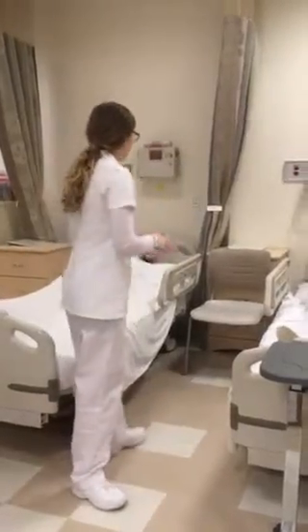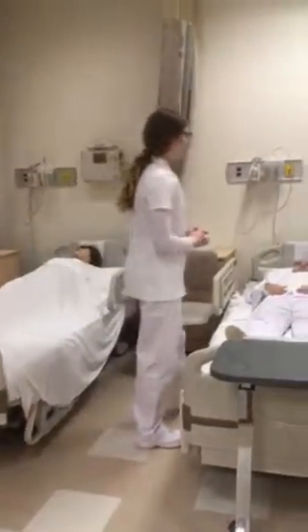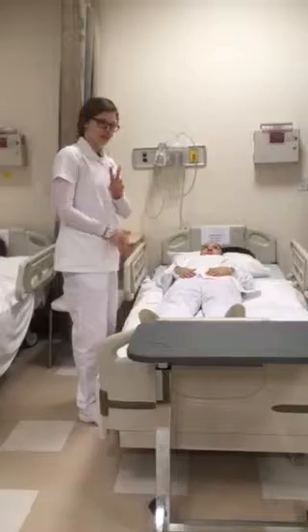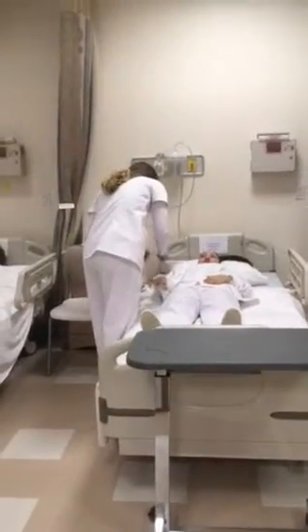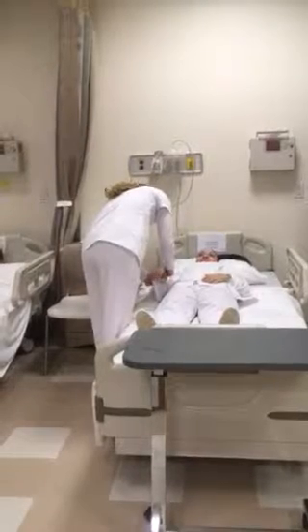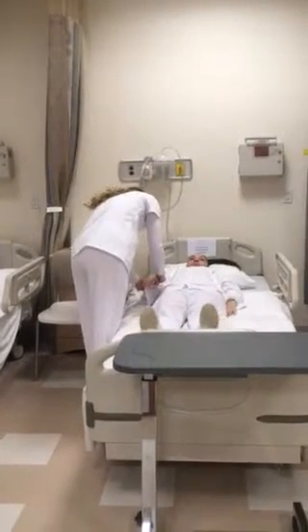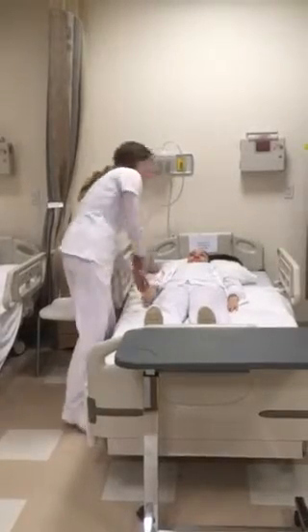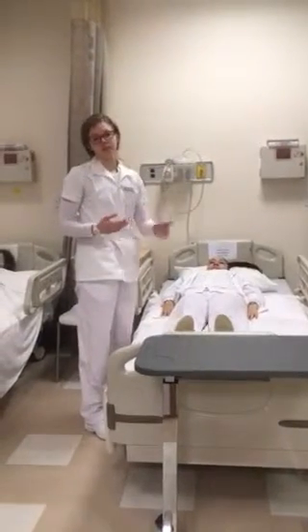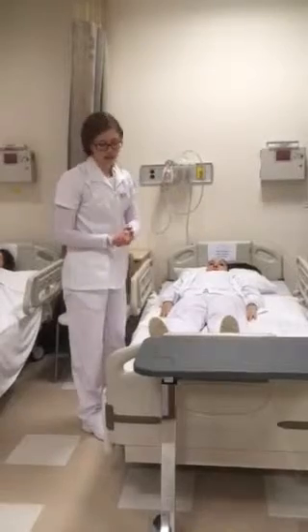Alright, so prior to coming into the room, I'm going to identify the patient using 2 identifiers. Hello, how are you today? Do you mind if I just see your wrist really quick? Alright, can you tell me your first and last name and date of birth, please? Alright, perfect. Thank you very much. And then the second identifier will be to check the MAR or whatever physician's order, and compare that.